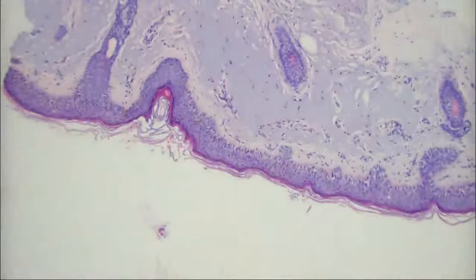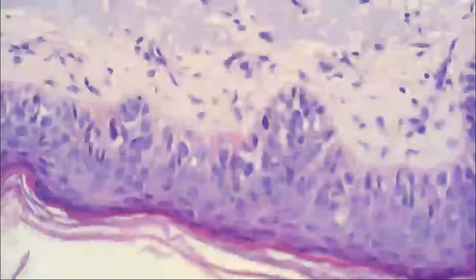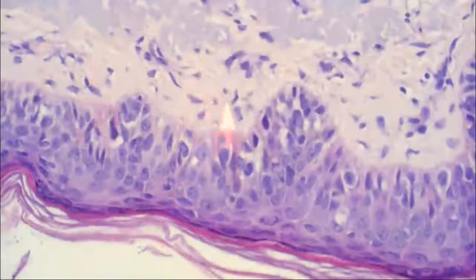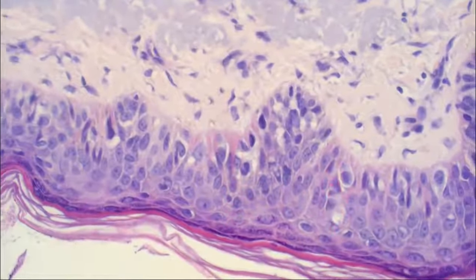And if you're really concerned, you do some immunoperoxidase stains if you wanted to prove that these were keratinocytes. You look at it carefully to see if there are some intercellular bridges around a lot of these cells here. So that kind of helps when you see that sort of change right there. So anyway, this was pagetoid actinic keratosis. They just look like regular AKs, so you can't really tell them apart histologically, clinically, from the other. Okay.